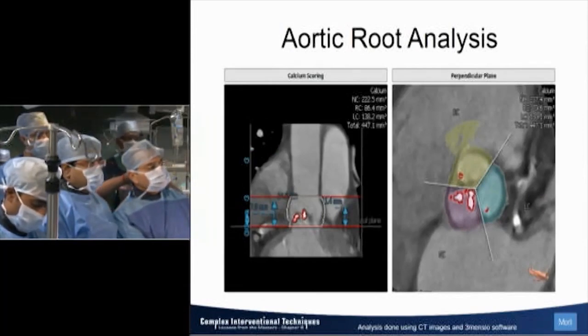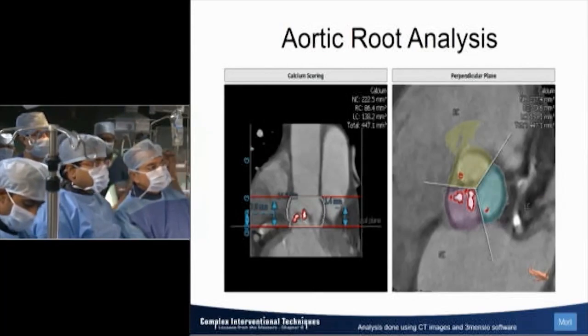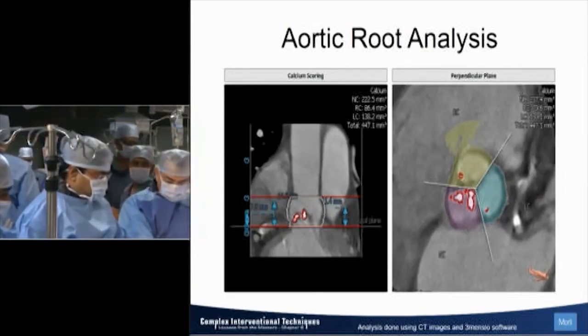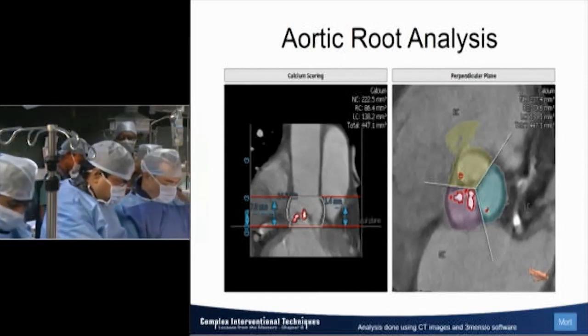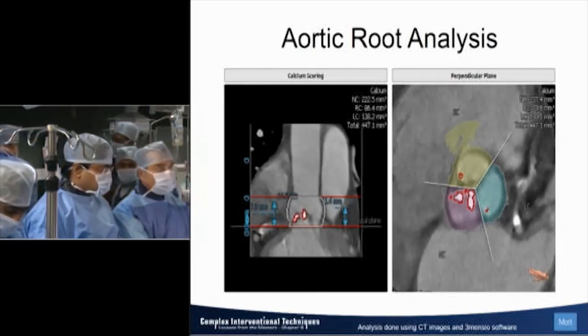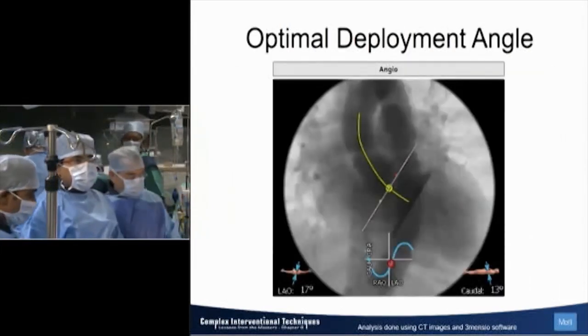So now maybe we can go live. What we have done is we have taken a 6 French access on the right common femoral artery, and we've put 3 ProGlides on the left side, upsized the left access to an 18 French sheath. We've crossed the valve using an AR catheter, and we'll be showing you the hemodynamics here. Okay, so we can go live now.